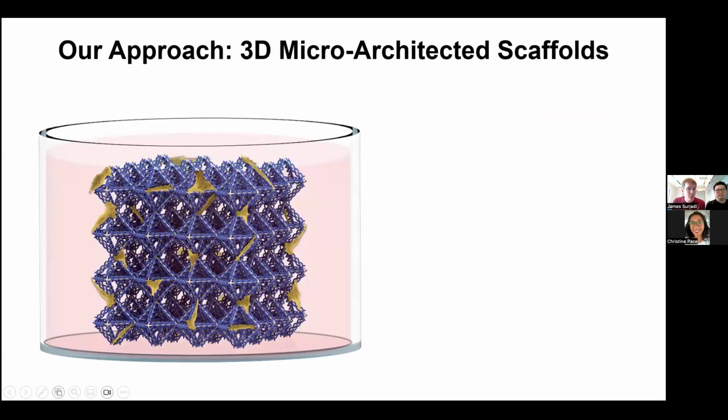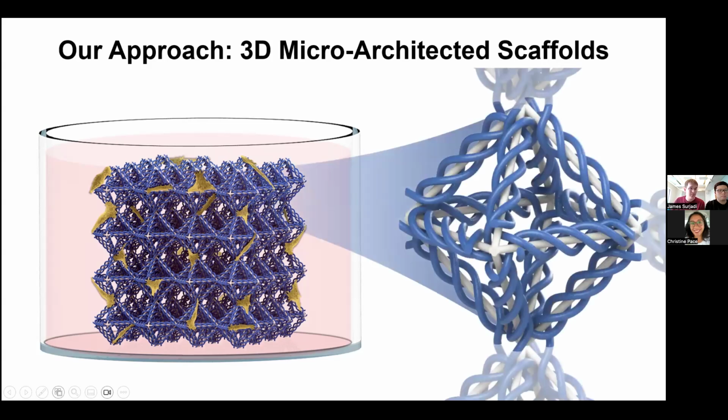In this study, we decided to explore how we can leverage microscale 3D printing to generate fully tunable cell microenvironments. As you can see in this close-up, we are able to engineer mechanical properties locally, at a cellular scale, and in a non-coupled fashion. For example, this means that we can choose to have an environment be stiff or soft while maintaining its porosity. We envision that this platform will allow us to study how certain cell types change their behavior or phenotype in reaction to local changes to stiffness, porosity, and so on.